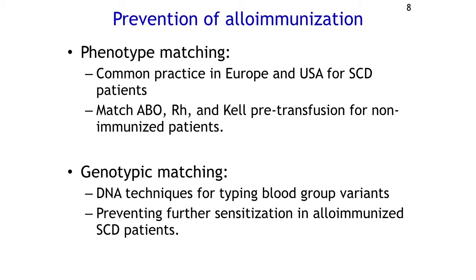You first immunize to show that we have a variant. And once we go to our patients who are antigen positive, don't expect them to form antibodies, but some will form antibodies. So in that case, we do their molecular immunohematology, we do their DNA and see the genetic basis of that anomaly.